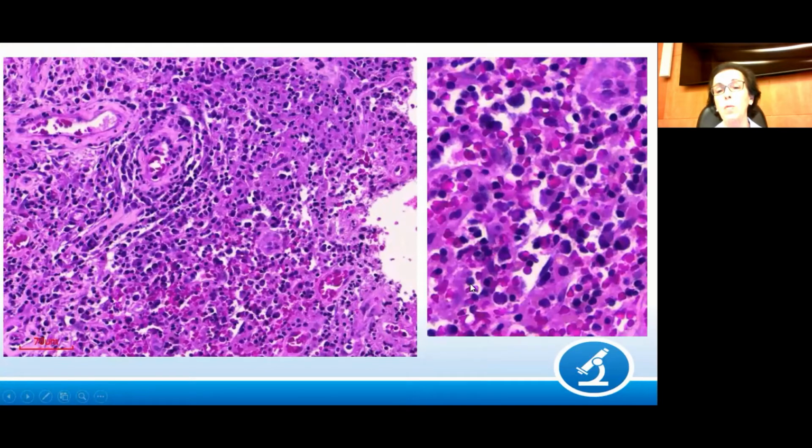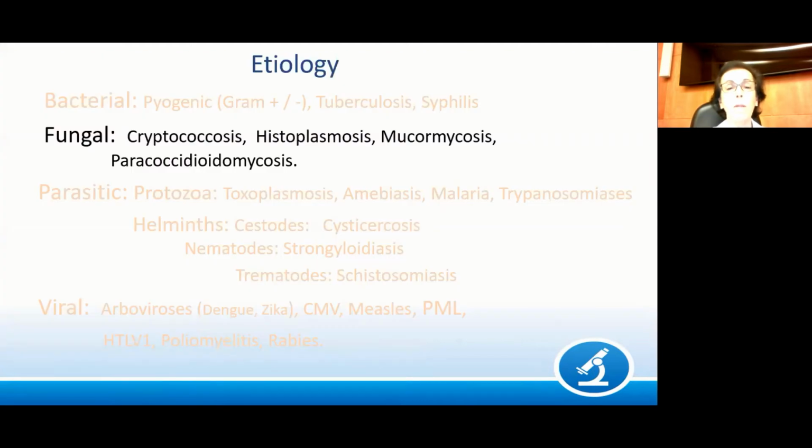When we see this, we have to think of syphilis. The special stain is not very easy to make. We have it. It's a silver impregnation, the Warthin-Starry. Sometimes we find organisms, but since it also stains the axons, which in this case are fragmented here, they may be mistaken for small organisms. So there is an immunohistochemistry, which we did in this case, but it was negative. But we suggested serology, the VDRL, for the patient, and it was positive. So this was a gumma by syphilis.